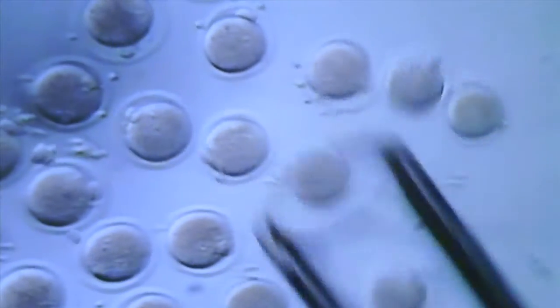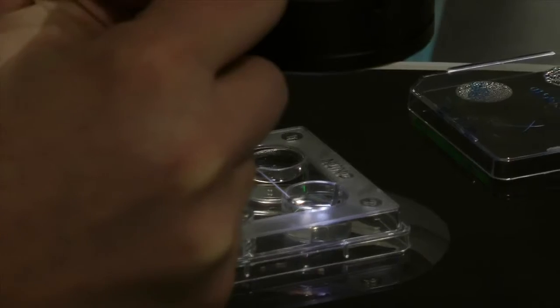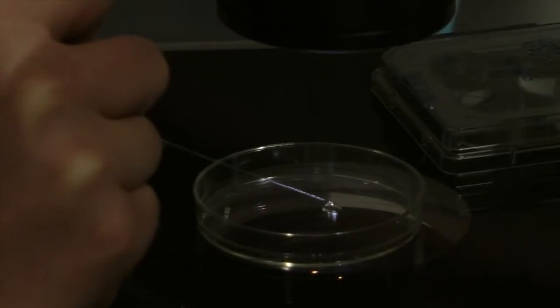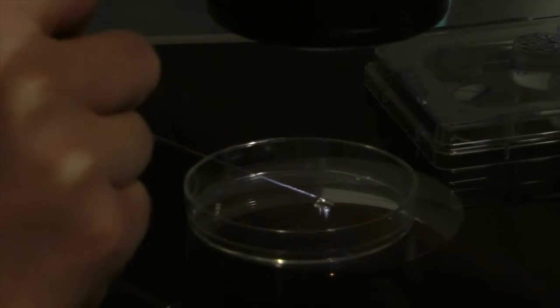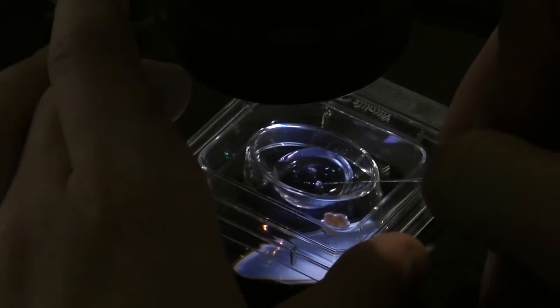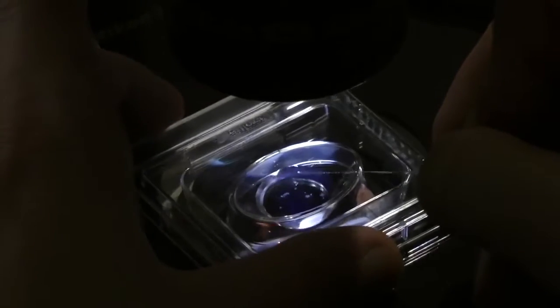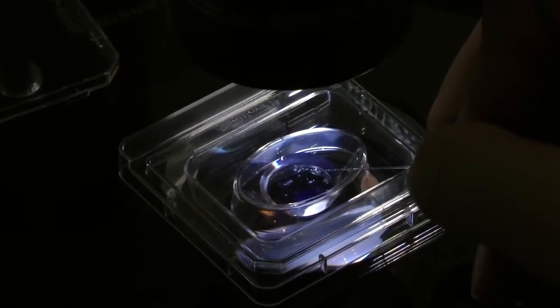The release criteria for the product is a series of quality control tests, one of those, of course, being the mouse embryo assay. For the mouse embryo assay, we're required to indicate the blastocyst development on day 5. Vitrolife uses a series of additional endpoints to determine the quality and the viability of embryos that have developed when exposed to raw materials and the finished product. While this information often is not on the certificate of analysis, it's utilized in the determination of whether or not a product is released or if a raw material will be used in the manufacturing process.